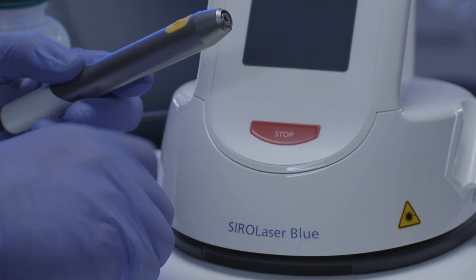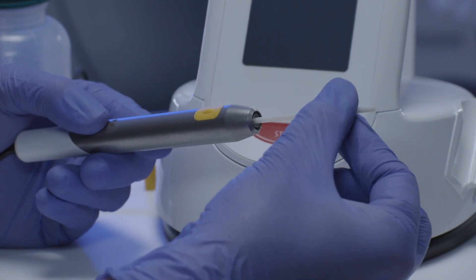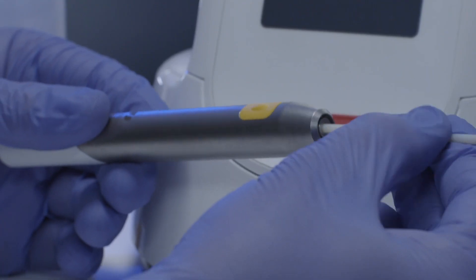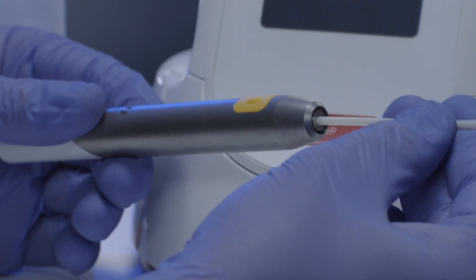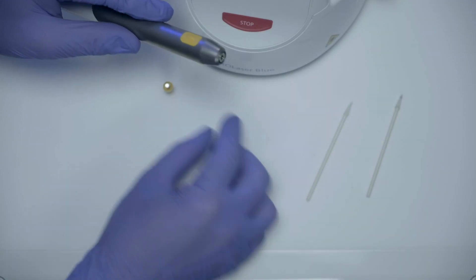Take a new dry lint-free cleaning swab to dry the handpiece optics afterwards by gently rotating the dry swab inside the handpiece optics. When you have finished the cleaning, make sure to protect the optical fiber socket with the protective cap.